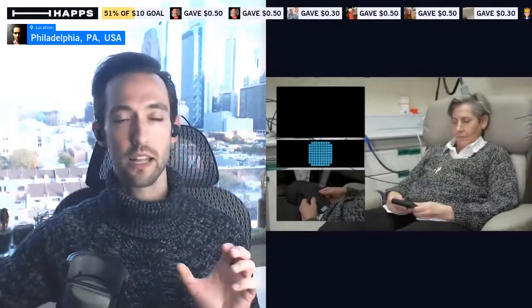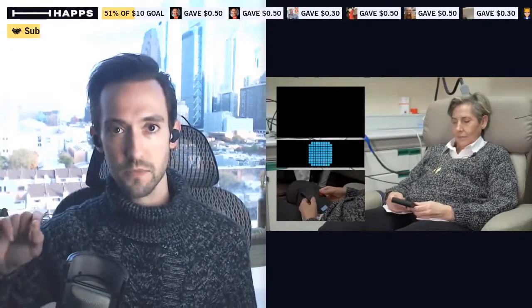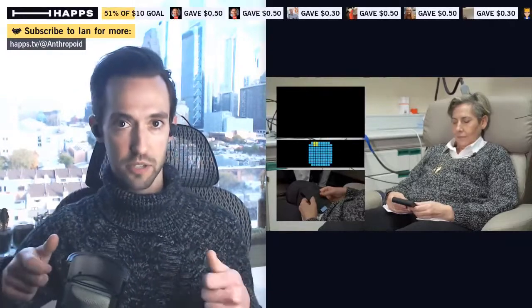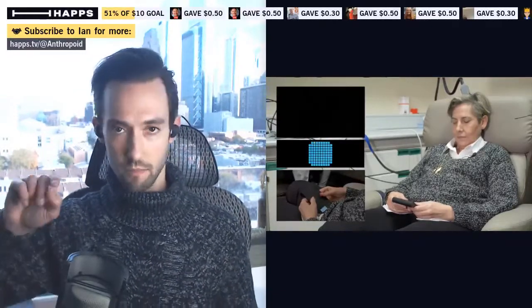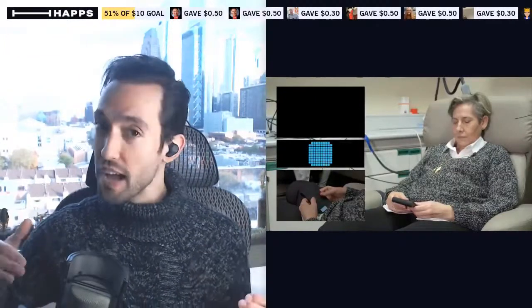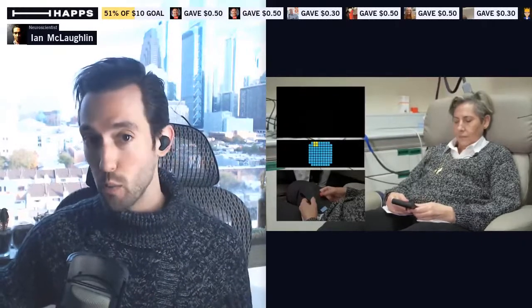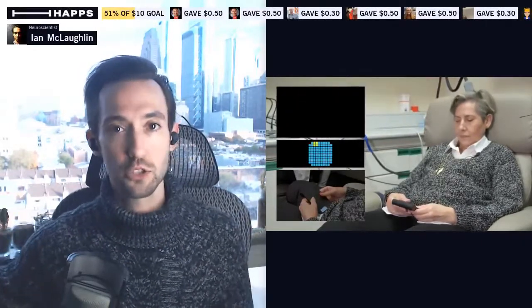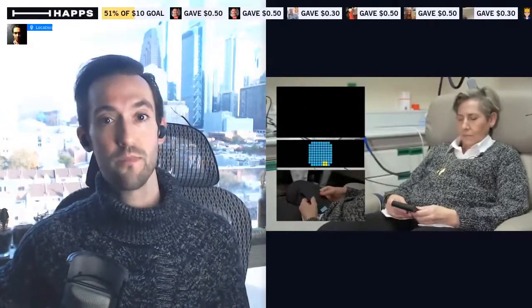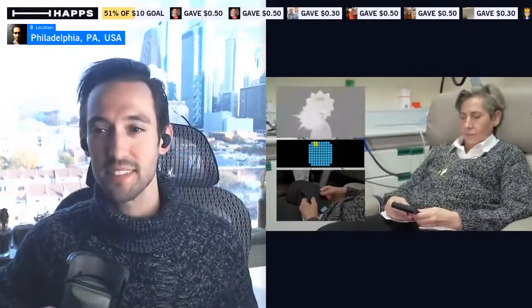It would be more like just a transient, short little flash of light, right? But Bernadetta could learn, the flash of light is here or it's here, right? And so that's basically enough to perceive things like letters, sidewalks, hallways, just very general visual experiences. And that can for sure be super helpful. But keep in mind, this was just one teeny tiny little implant.